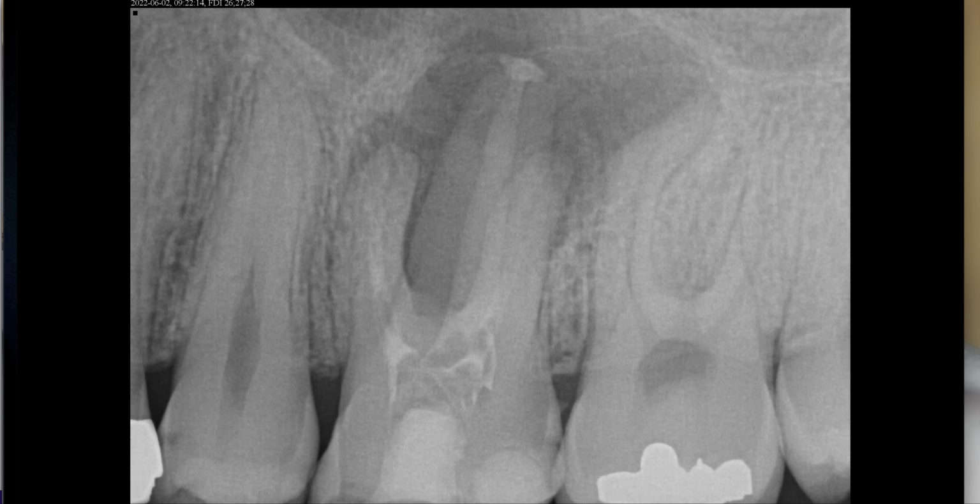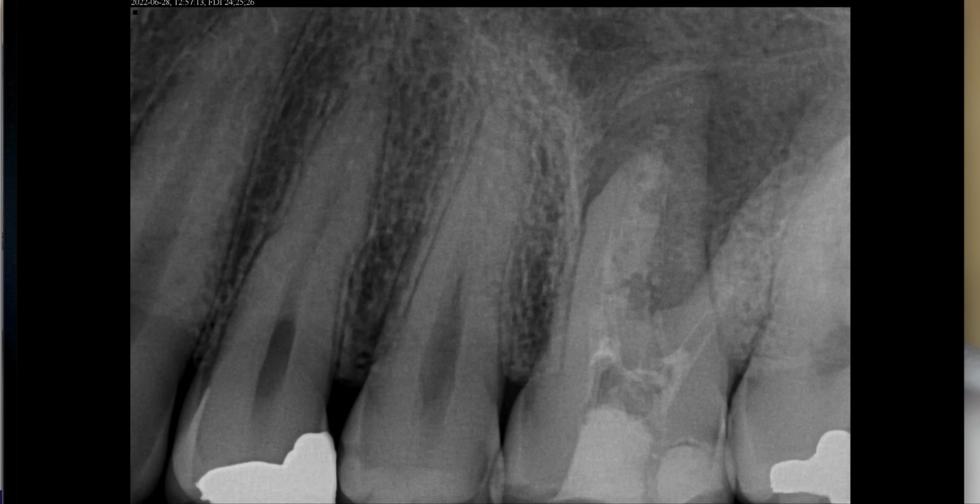I'm not going to go through the initial treatment. I put that on YouTube if you want to take a look at it. But this is the calcium hydroxide right after we placed it. We had found MB1, MB2, and the palatal canal. We used lots of calcium hydroxide, and then distal buccal, we're good. Then we placed some powdered calcium hydroxide, which is 100% calcium hydroxide. The calcium hydroxide in the canals is UltraCal XS, which is roughly 33% calcium hydroxide, and the powdered is 100%. It's 33% because there are radiopacifiers, and I think propylene glycol, just to keep it in a liquid state.